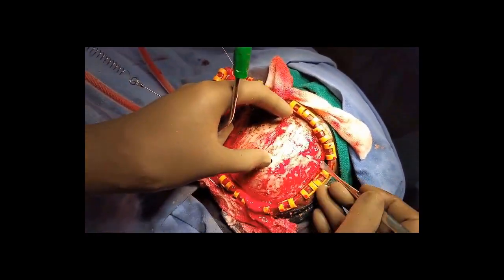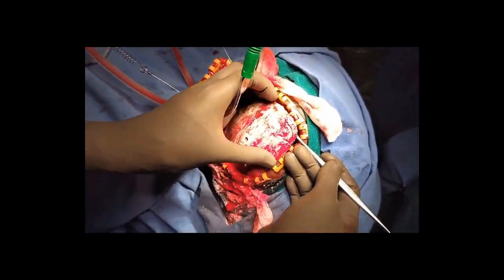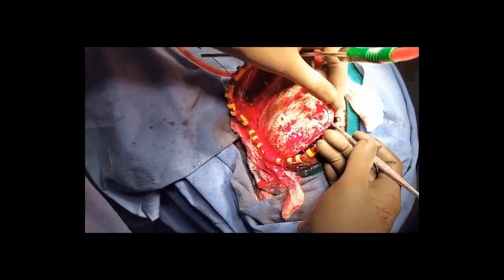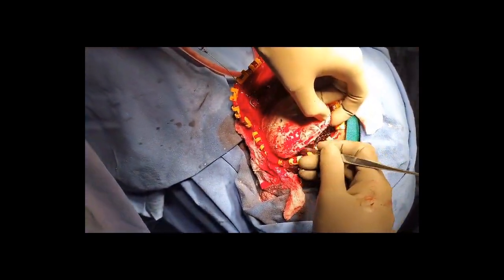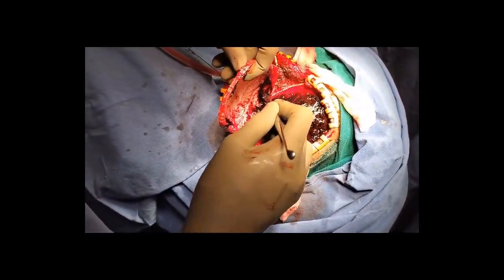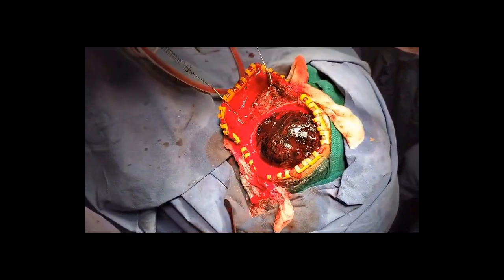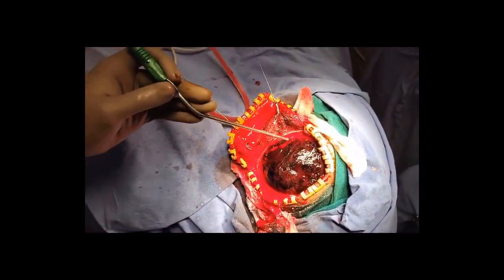But if you see the scan, you can see there was a huge extradural hematoma, which is hyperdense, and after doing a standard square flap, there is a huge clot just below the bone flap, and it looks like the hematoma was very big. Evacuation is planned for this.